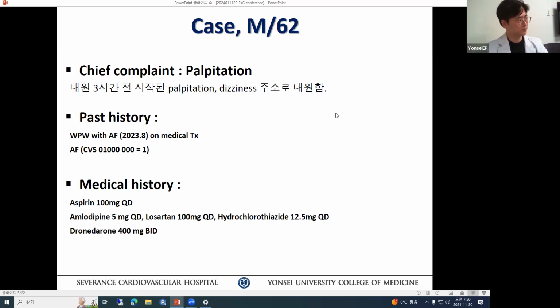So atrial fibrillation is what triggers it. I had a similar case not too long ago, last year. I think I went to Incheon, a Korean hospital there. A lady came in, 52 years old, hypertensive and overweight, and she had pre-excitation from a posterior pathway. She had a sudden death. They studied her, and there was a bystander-only pathway. In the EP study, we learned that she had right pulmonary vein focal tachycardia, actually triggering the pre-excitation.